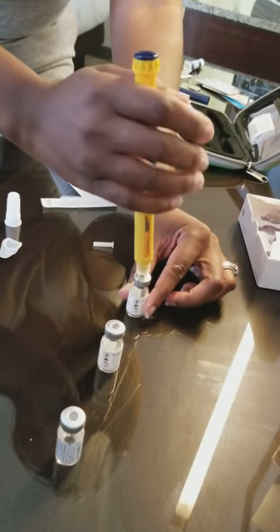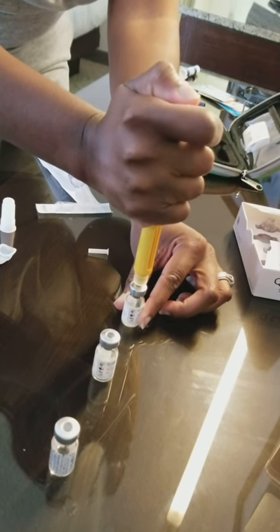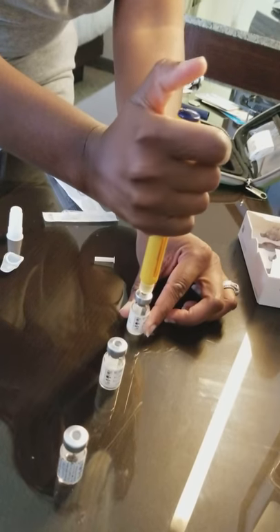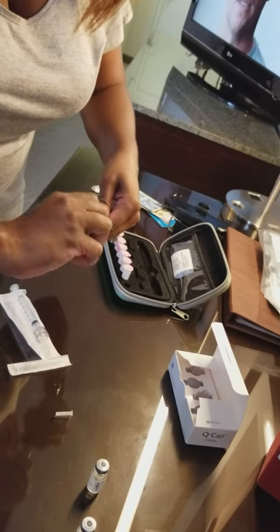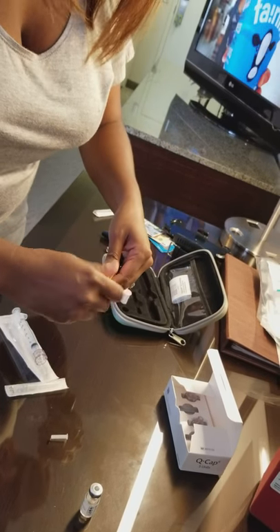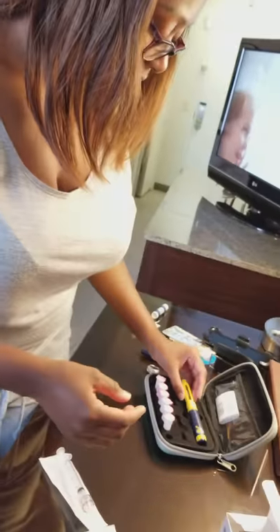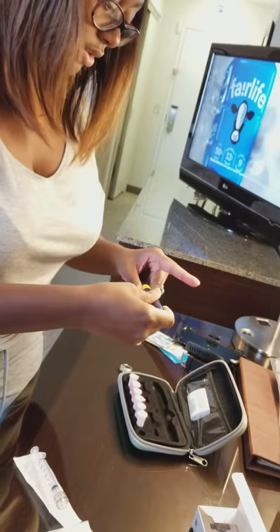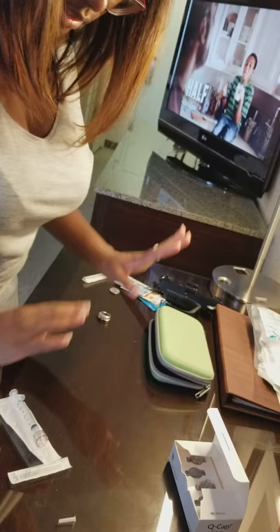So we stick that in there and push it all the way down until it locks, and we take it out. We put the cap back on and take off the needle so we're not touching it, and we discard it. We still have a little bit left in here — we can put it back in the refrigerator for tomorrow's dose. So that's done.